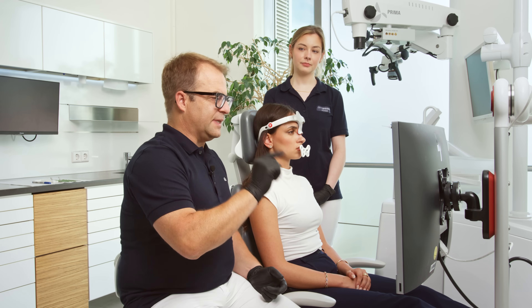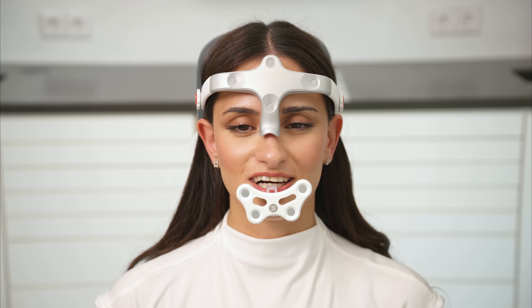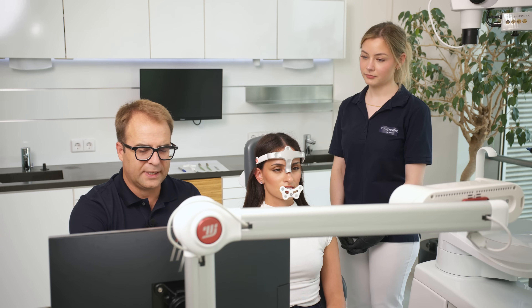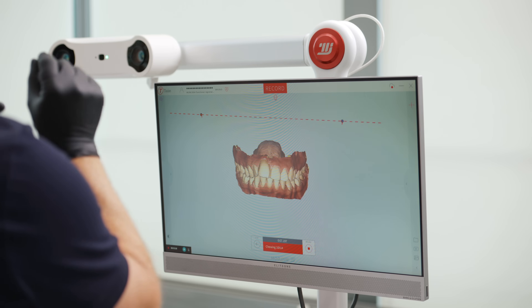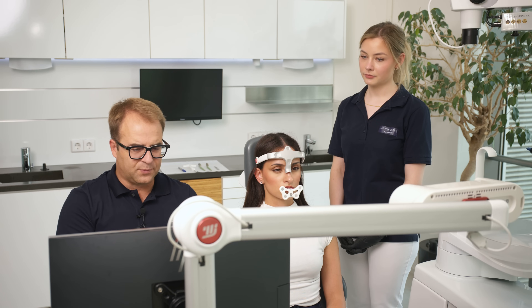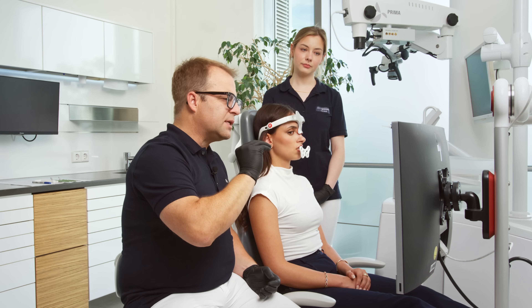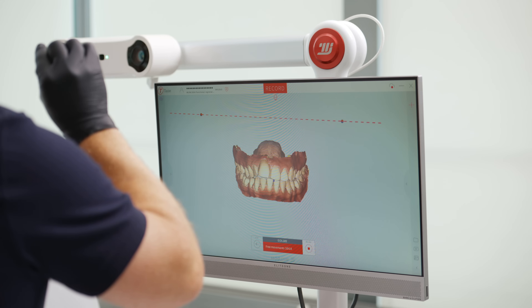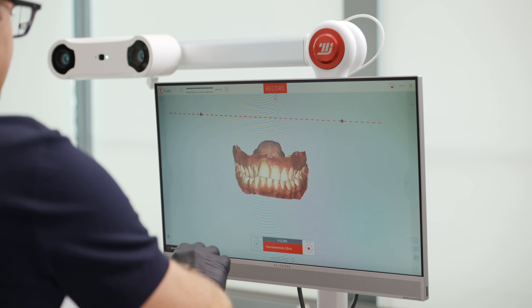One of the last recordings is speech. I ask the patient to count from 50 to 60 in a normal way. After speech, we record chewing — the patient chews as if they had something between their teeth; optionally, a small piece of apple or chewing gum can be used. The final movement is a free movement in a small manner — small open-close movements, faster and smaller. This is important for calibration of the hinge axis.